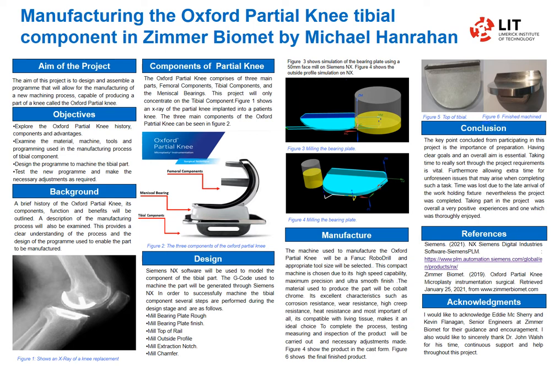The components of the partial knee — there are three main components: the femoral component, the main component itself, the bearing, and the tibial component. The tibial component is the component that I will be concentrating on here.